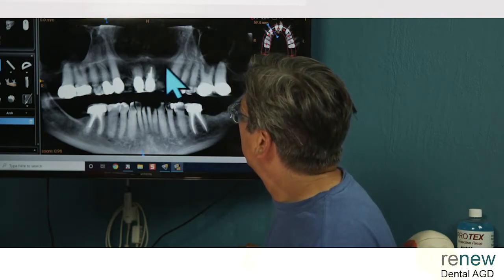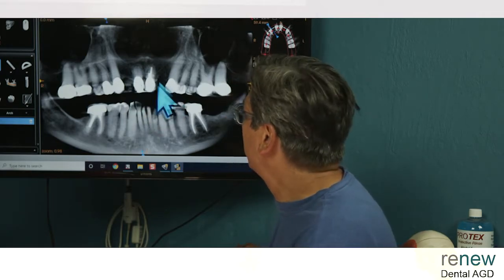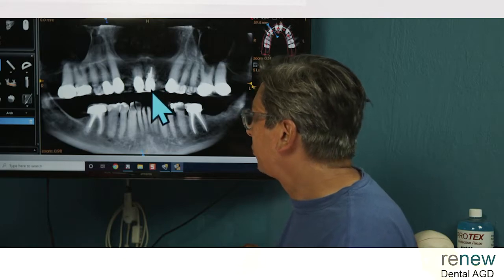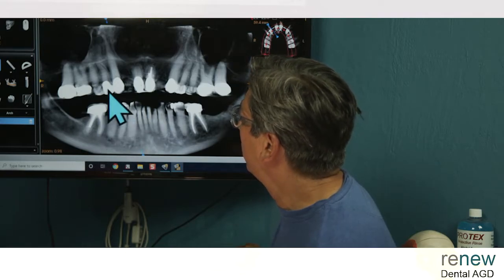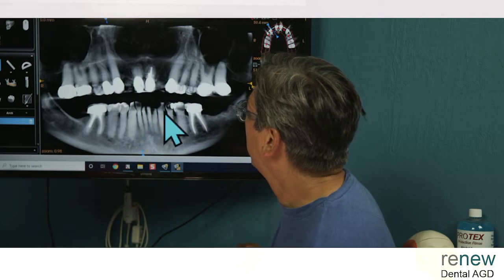Here's a Panorex view, and it actually looks pretty good. The bone height here doesn't look too bad. Here's where the bone is, and this patient's coming in with a fractured front tooth with the root canal, and he's got his primary occlusion here and here, so he's eating okay there. Maybe he needs a new crown there.